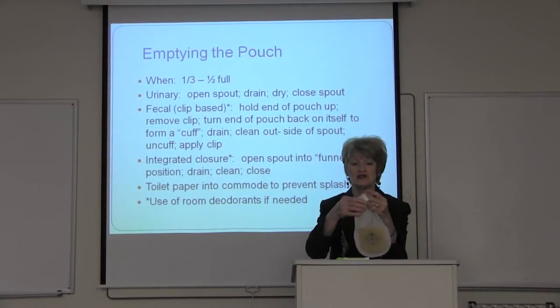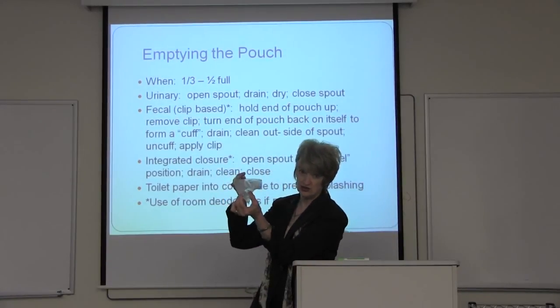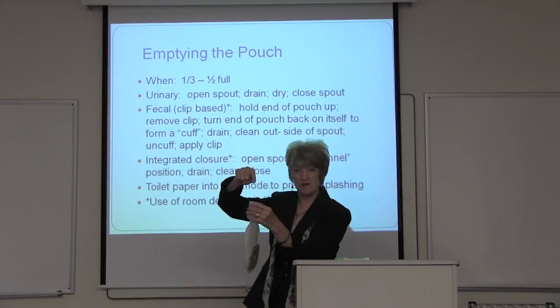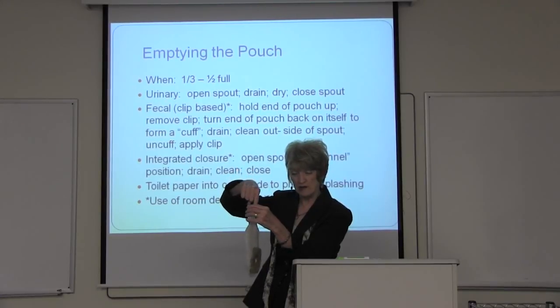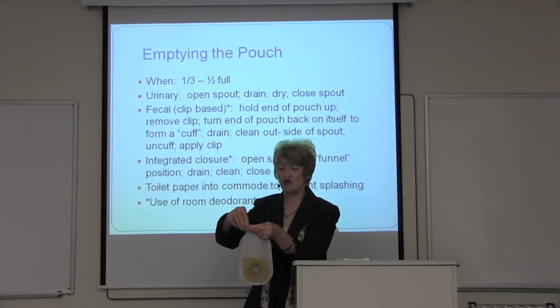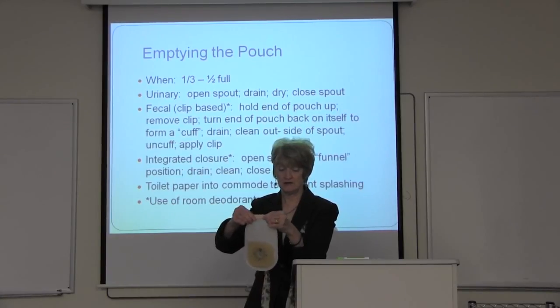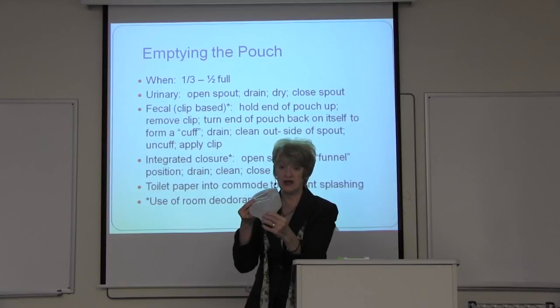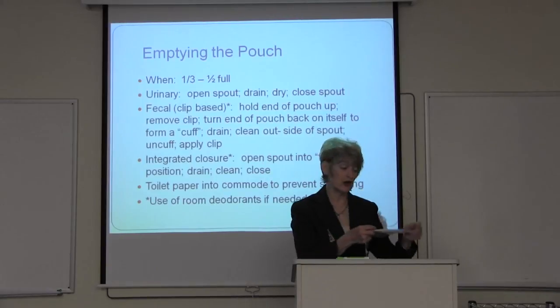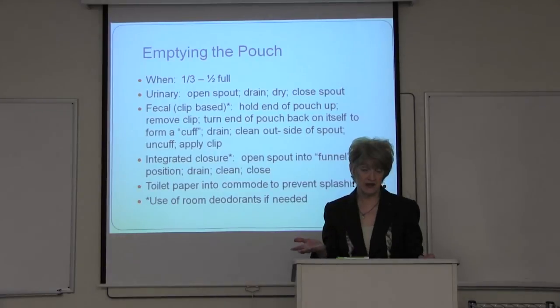So that little cuff technique is a very important thing to teach patients and caregivers if you're using clip-based pouches. If in your system you have integrated closures, they have to be pinched to form a funnel, and then you drain the contents. You have to take either a wet one or toilet paper, clean on the inside, drop that, and then you always fold up toward your nose and close it. And again, the end stays clean. So different techniques for integrated closure and for clip-based, but your goal is no stool on the outside of the pouch, nothing that can cause odor.